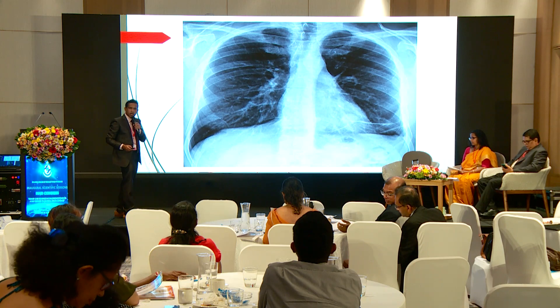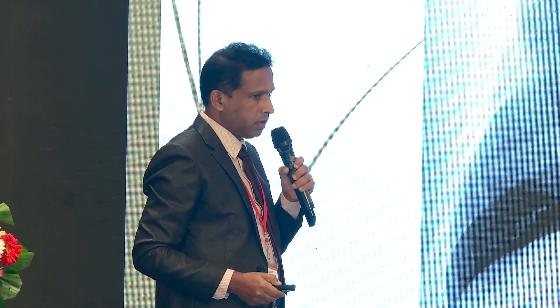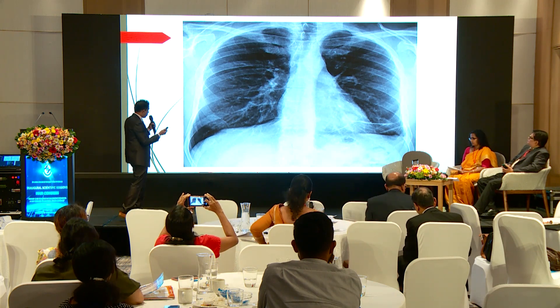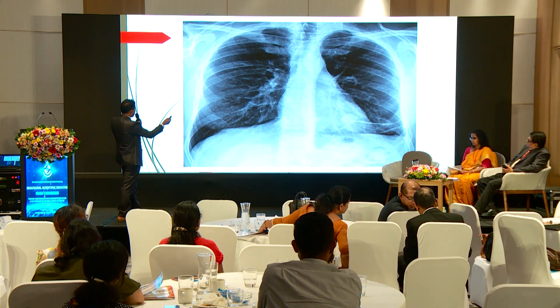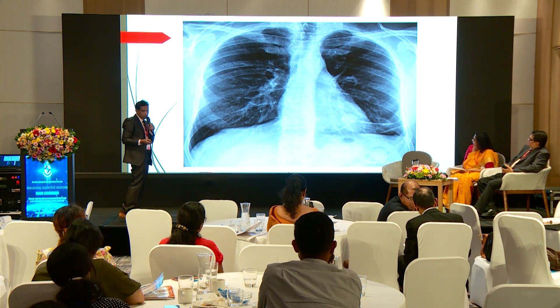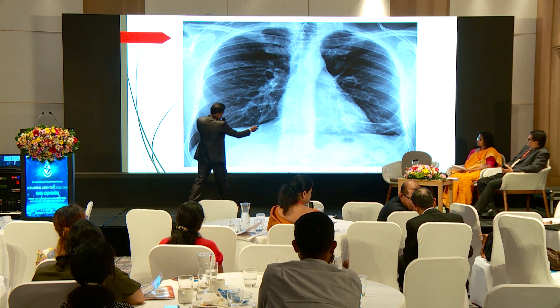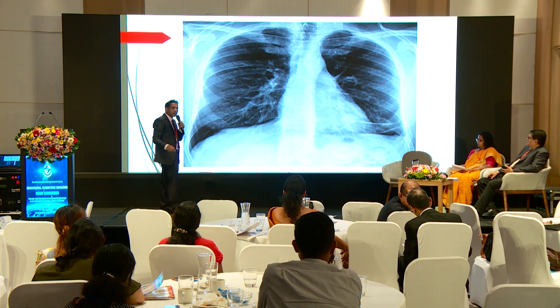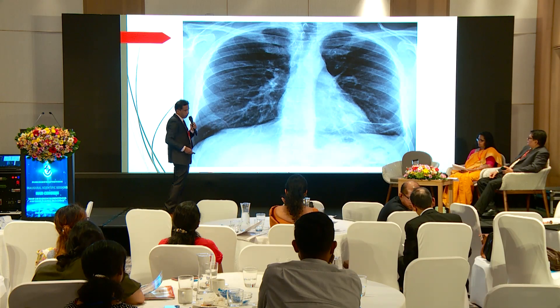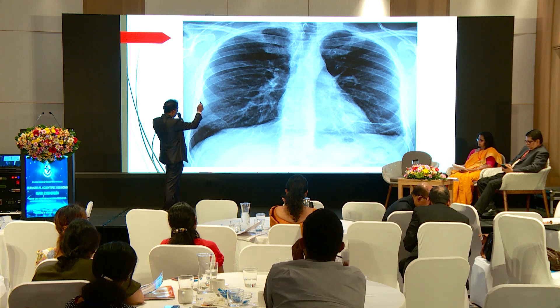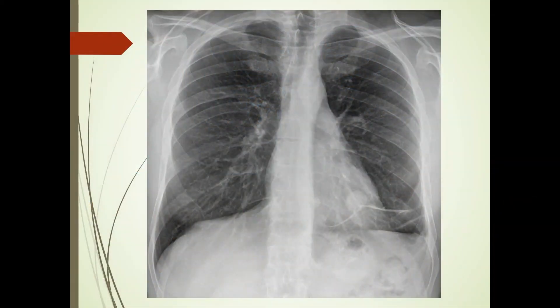This is another X-ray. What is the abnormality? It may also look like a normal X-ray — both sides of the lungs appear normal, no cardiomegaly, no obvious abnormality. But if you look carefully, there is a rounded nodule in the retrocardiac region. This is a retrocardiac lung mass, which could be malignant. We can't miss this. There is also subtle atelectasis and small pleural effusion on the left side, but the key finding is this nodule. The second message: always look at the retrocardiac region for subtle masses.